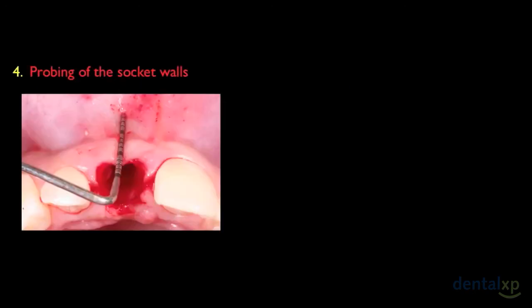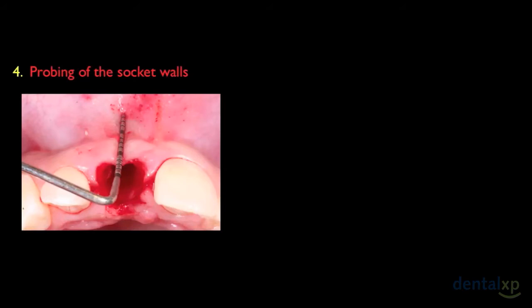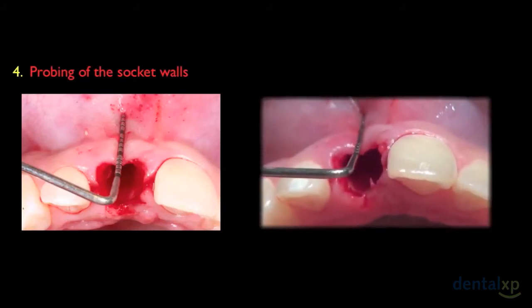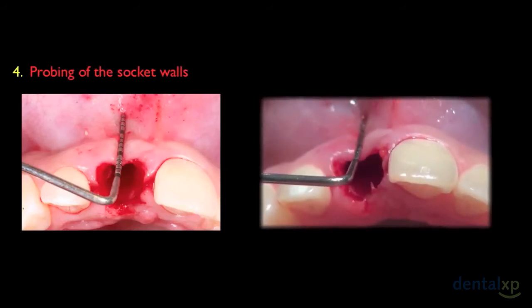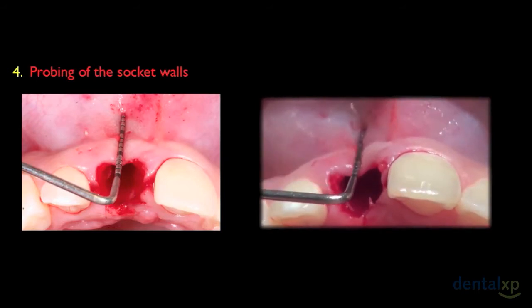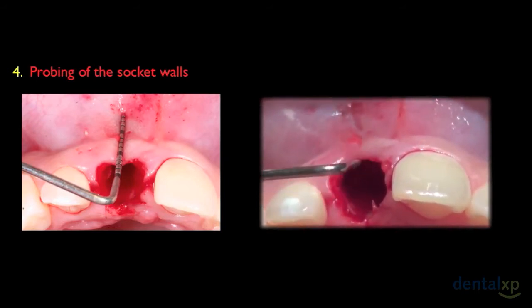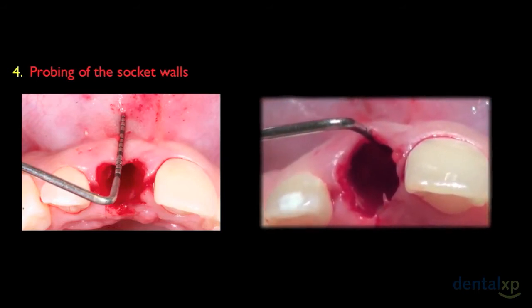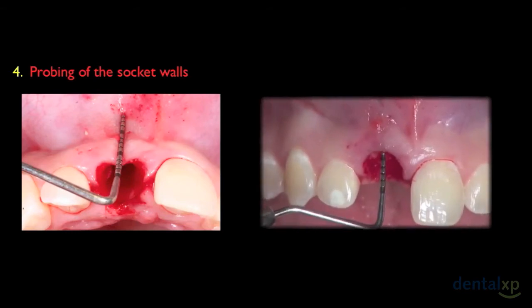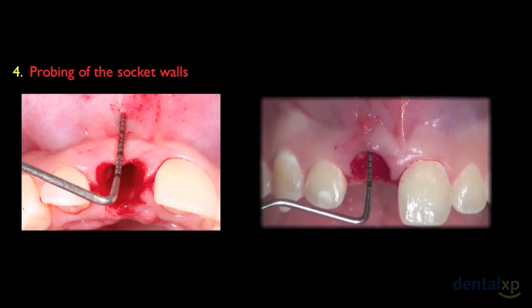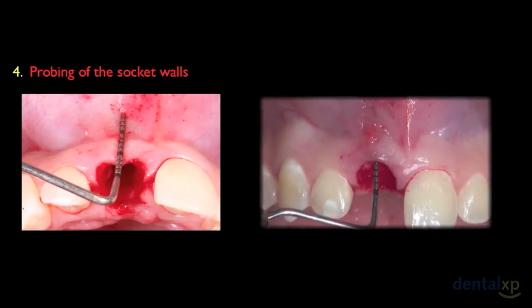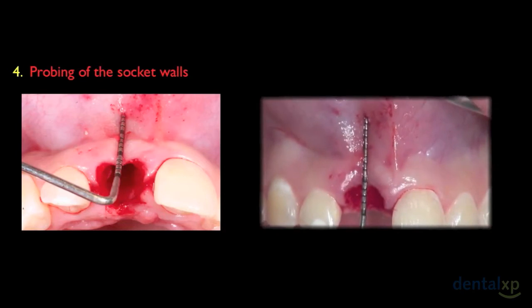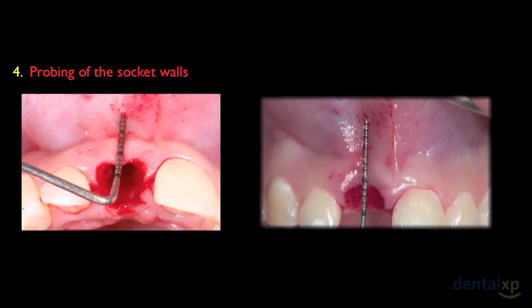The following step is probing of the socket walls to assess the extent of the bone damage. We will assess the defect in height and width. We can confirm here a total absence of the buccal bone wall.